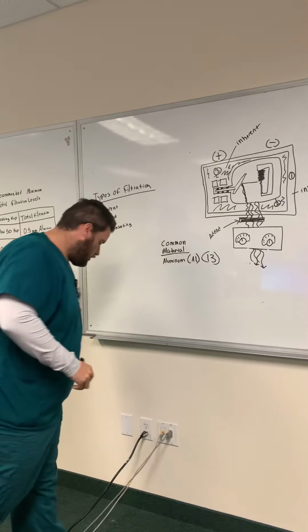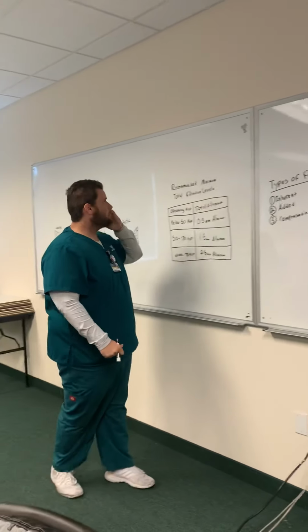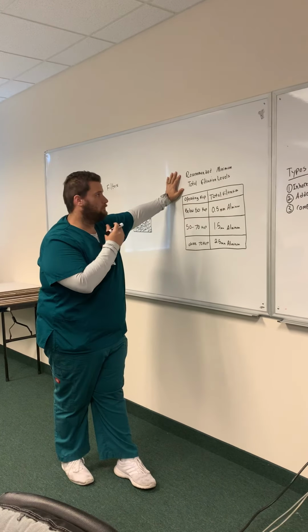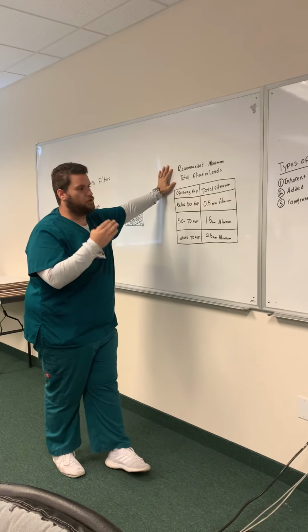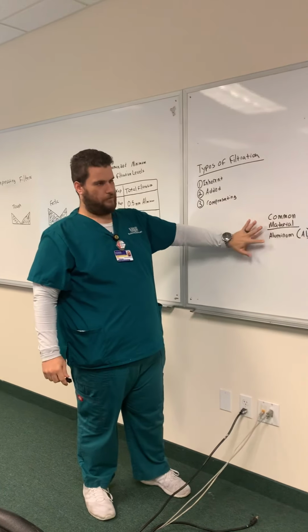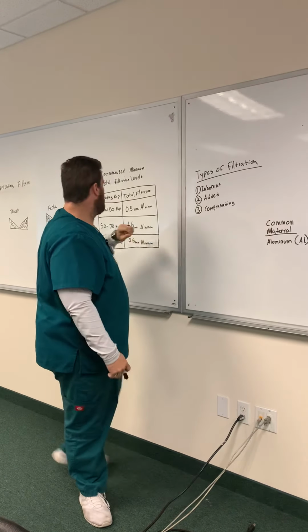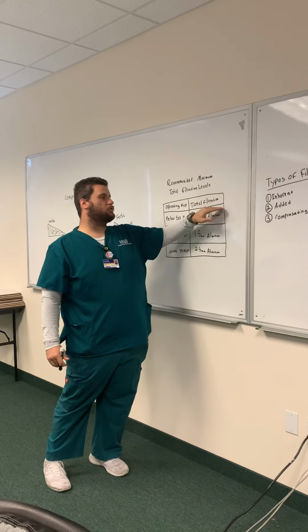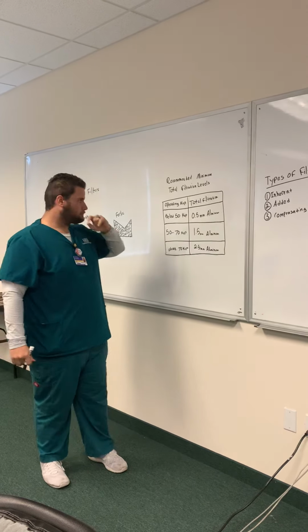Okay. Now we're going to move on over here to the recommended minimum total filtration levels. And we're using aluminum because that is the most commonly used filter material. Now, I have the operating kVp, and I also have the total filtration with aluminum.